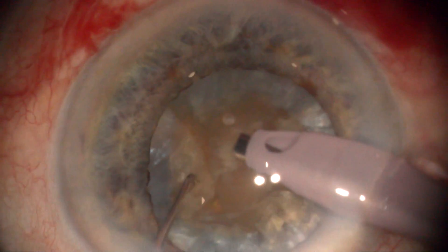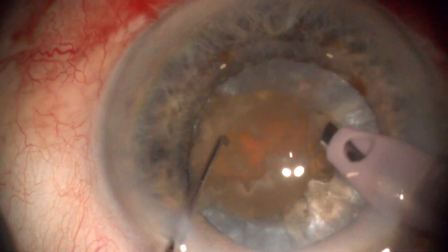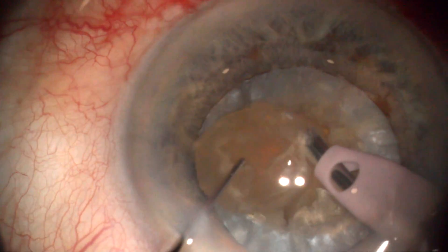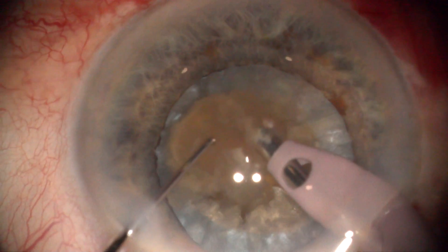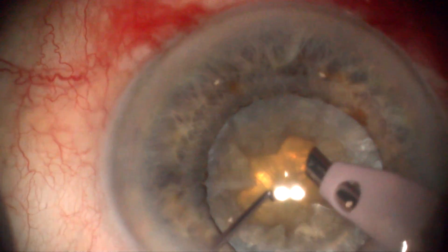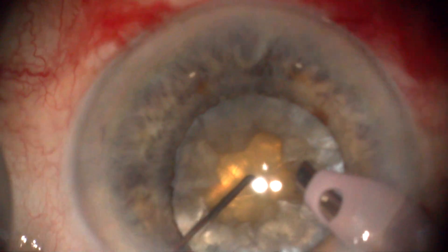In this case we take the endonucleus out of the bag for illustration purposes. We usually emulsify it inside the bag, far from the endothelium. We obtain a deep protective bowl for safe in-the-bag fragment emulsification.